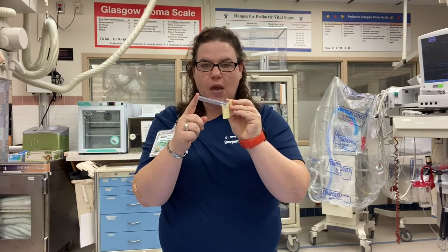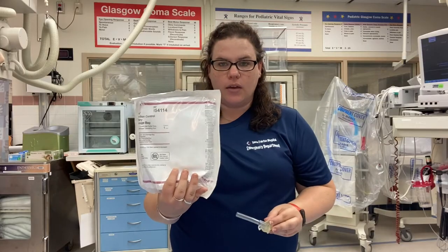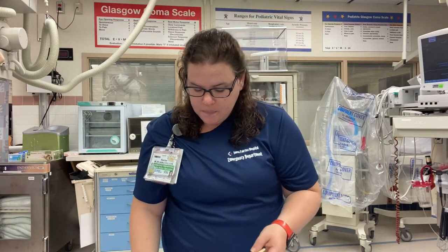You've got to hook a drainage bag to this end — you can grab a regular Foley bag drainage and connect it in. It also comes with its own stat lock so that you can attach it to the patient's leg. Continue to monitor your I's and O's for your patient, same as for your female external cath patients.